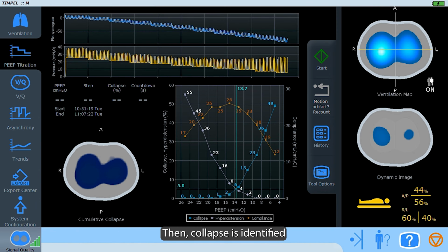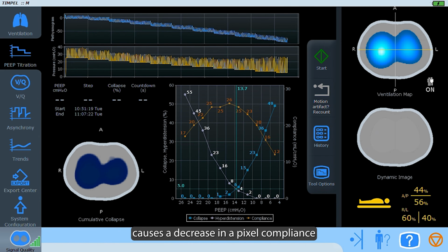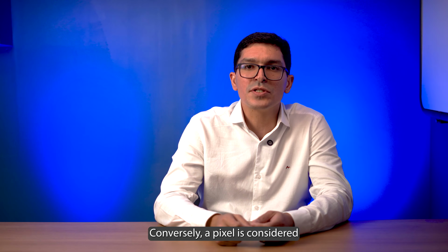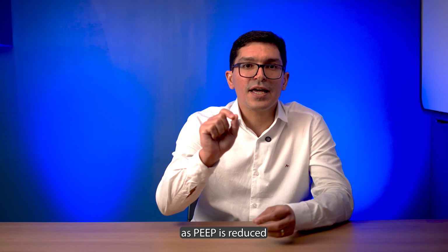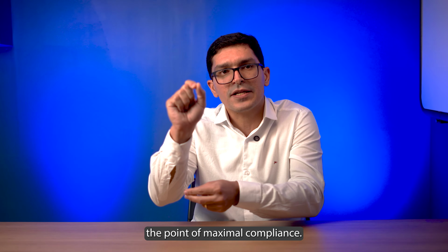Then, collapse is identified when a reduction in PEEP causes a decrease in pixel compliance after reaching the point of maximal compliance. Conversely, a pixel is considered to be experiencing overdistension if its compliance is increased as PEEP is reduced until reaching the point of maximum compliance.